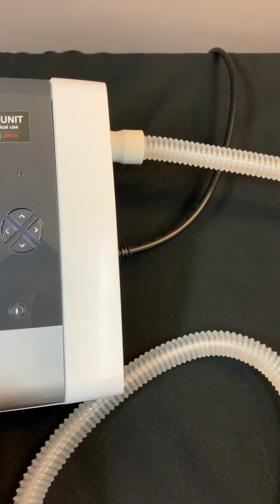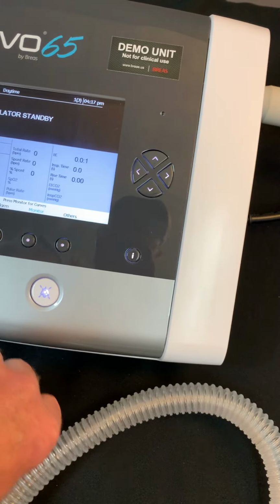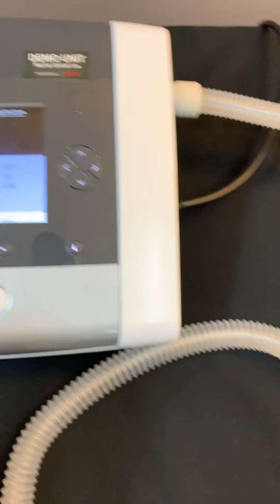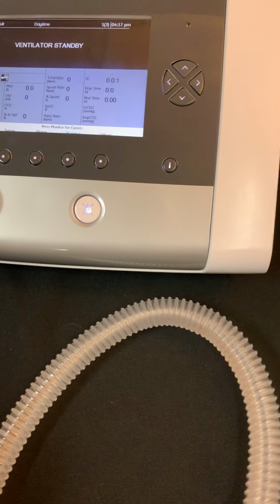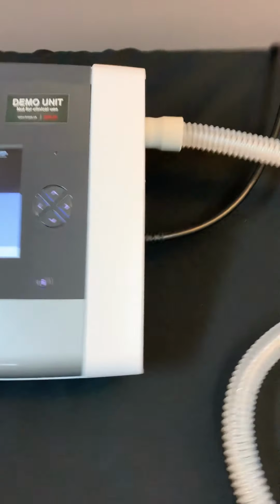So I'm going to go ahead and connect the leakage port back on the circuit. And again, trying to do this with one hand. I'm having a little bit of difficulty, so just hold on one second as I set the phone down. Okay, so I've got the leak port connected, I've got our patient connected.